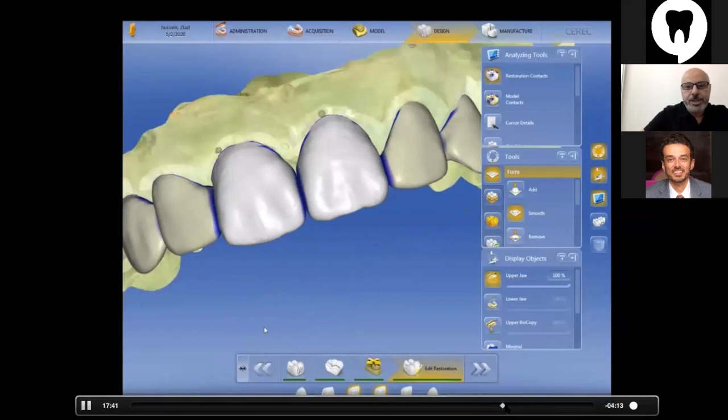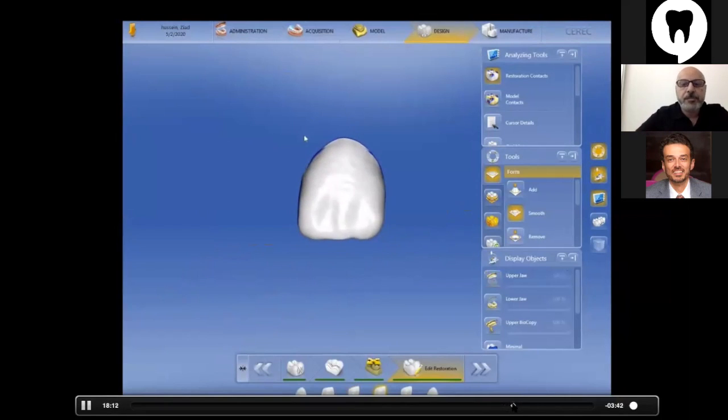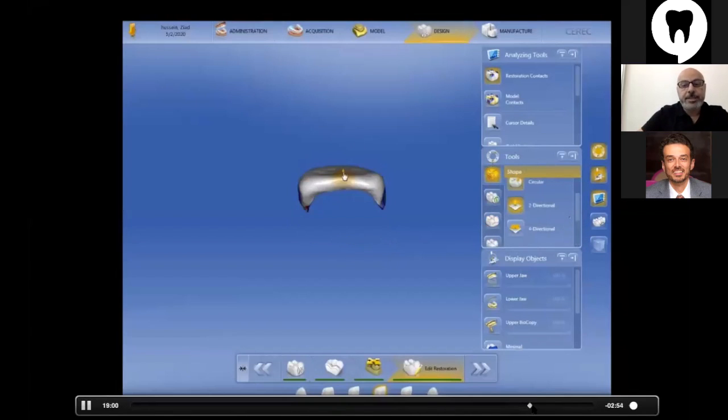This is the final shape. You can see them on both centrals. This is one of them, of course, just to watch it closely for all the details and look at the light reflection on the teeth, on the labial surface, showing the different anatomy or different texture on the labial surface. So this is how we finish the incisal variations, the incisal anatomy.